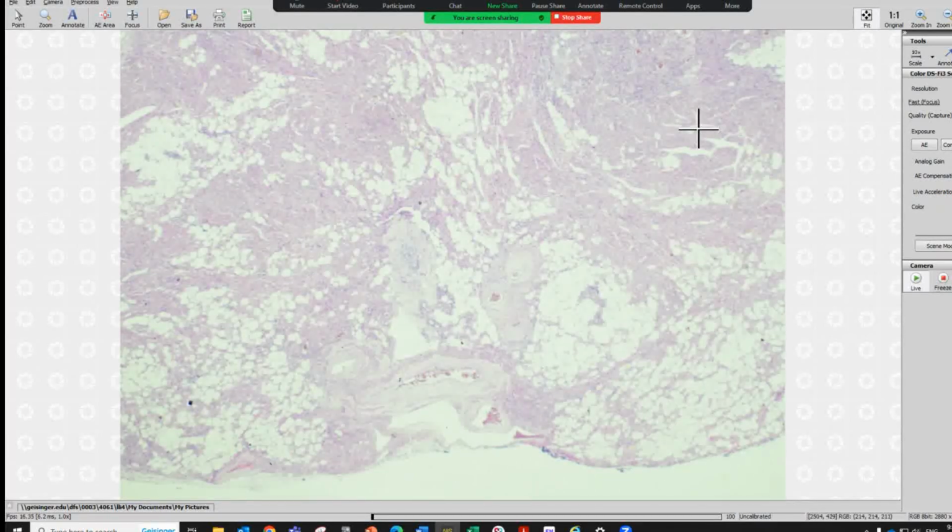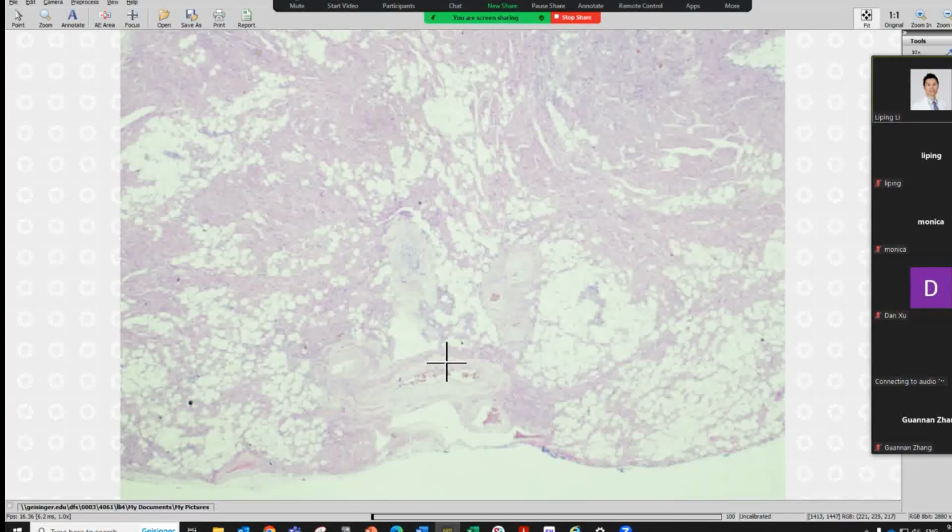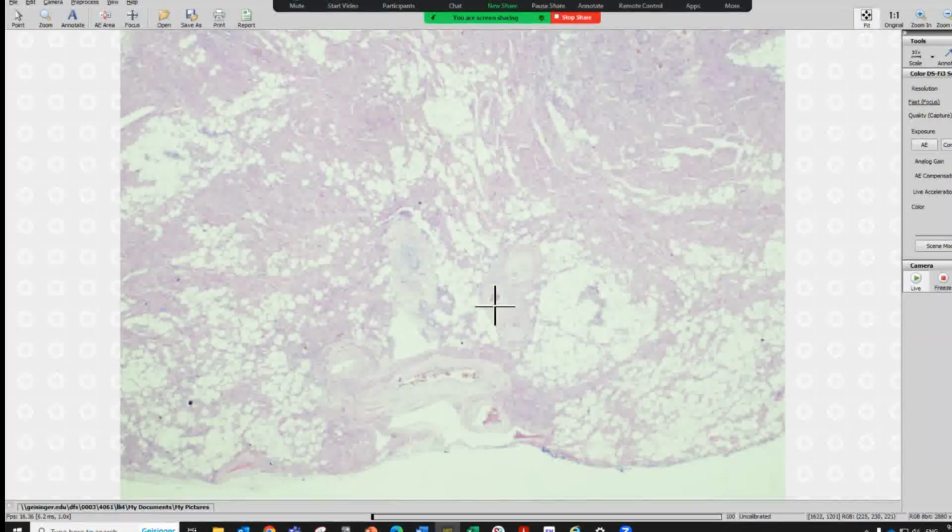This is an AML, because we can see the triphasic pattern: a lot of vessels, and the characteristic vessel of this entity is thickened, with a really thick wall. Angiomyo, that is these eosinophilic cells, our muscle cells, and lipoma, that is this fat. So we have three nice components of this entity.